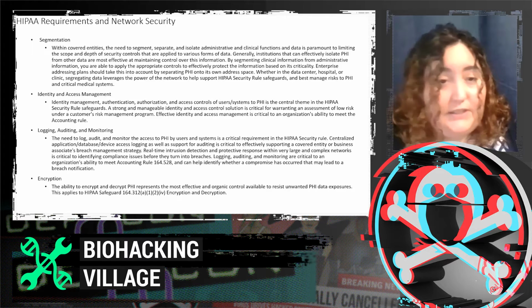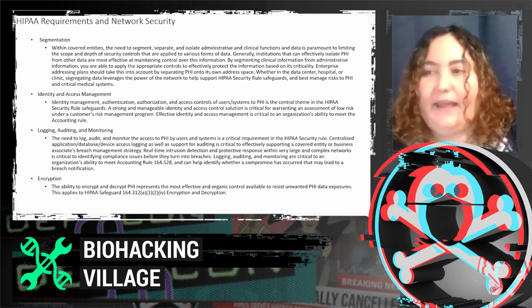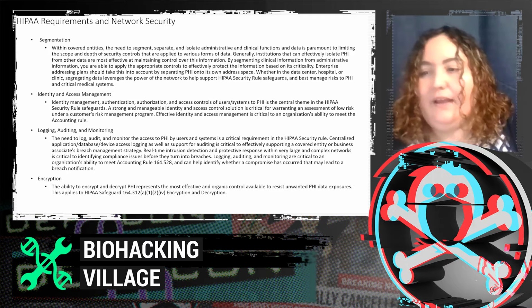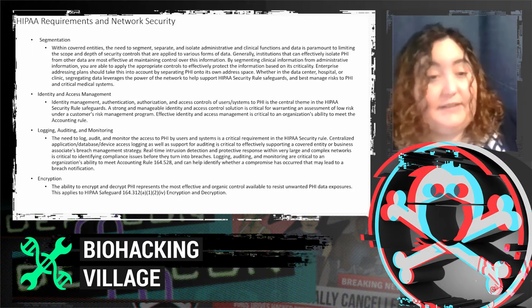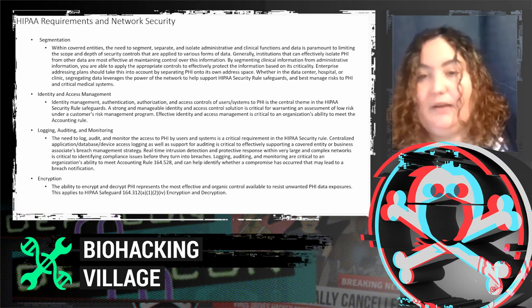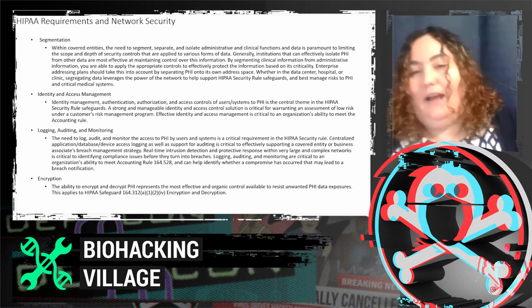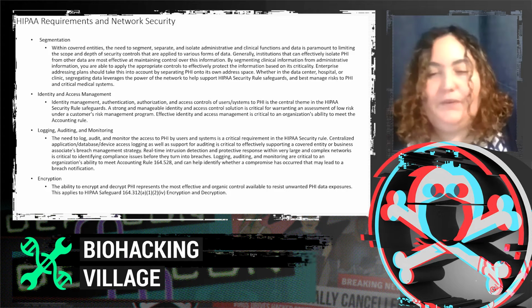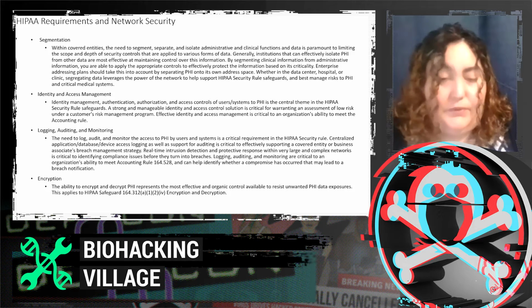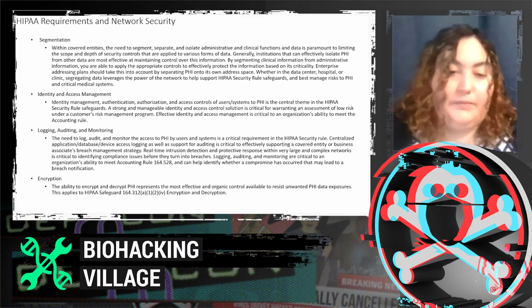Now, we're not just coming up with network security requirements out of the air. There is HIPAA support, there is industry support. Hospitals need to protect their sensitive data. Network security for the uninitiated and overworked, I understand that it's really difficult, but hopefully with this primer, you'll be armed with the tools to at least ask the right questions of your external consultants or Dr. Google.